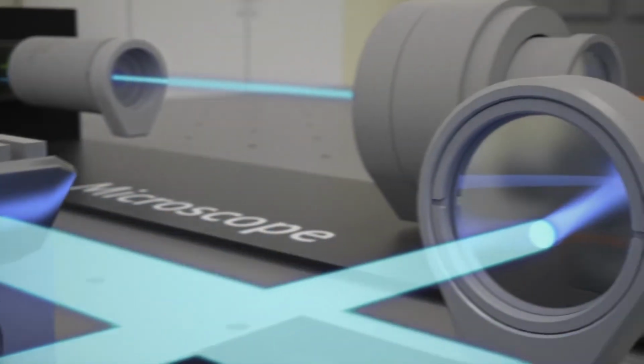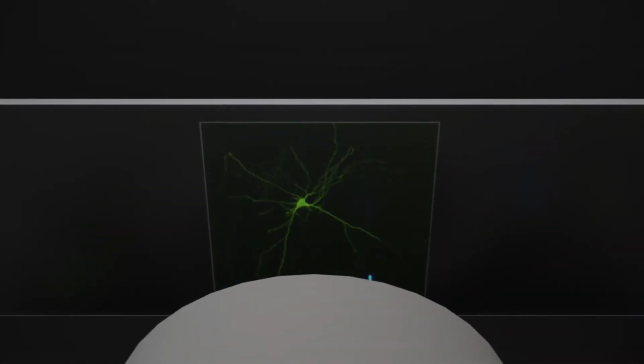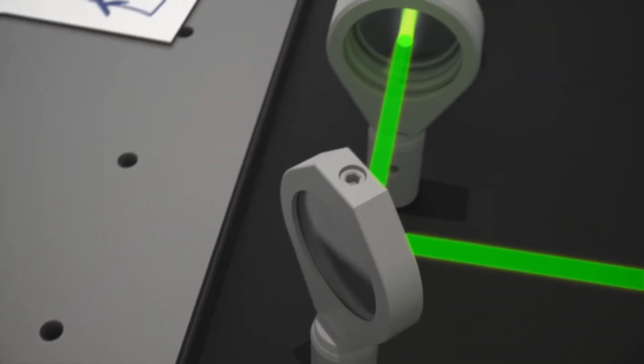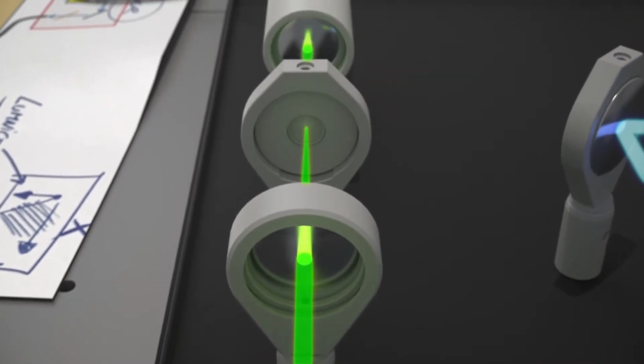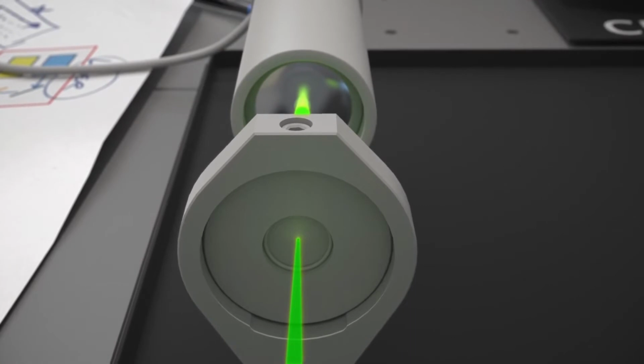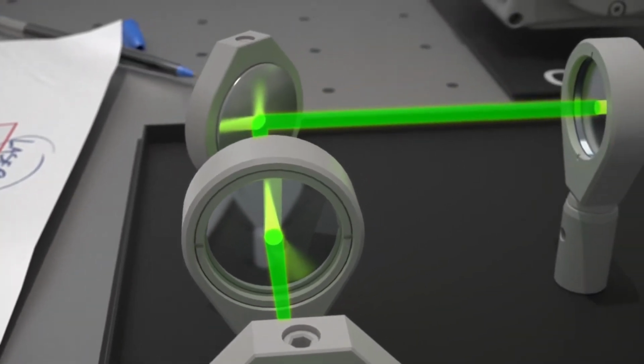Since we just mentioned that confocal imaging can only be a point, we need to change the optical path to change the imaging position. MEMS galvanometer can change the angle of the reflecting lens to change the entire optical path, so as to achieve the purpose of scanning teeth. 4. Depth of focus control. The control of focus depth is the key and the most difficult link of the whole confocal scheme. How to accurately control the position of focus is the core secret of the technology.